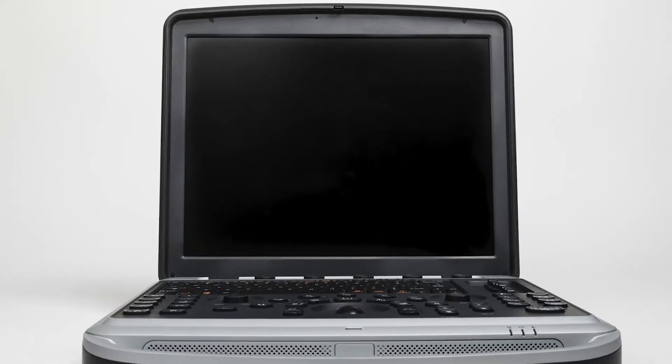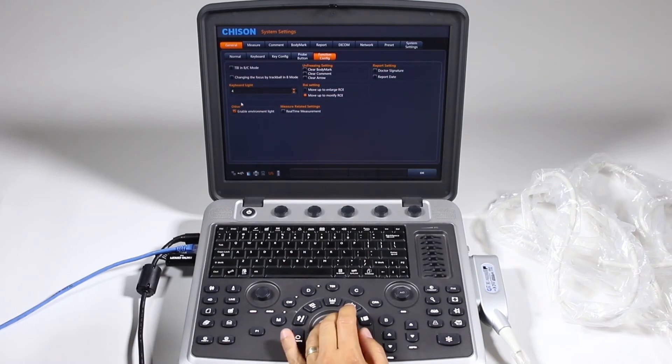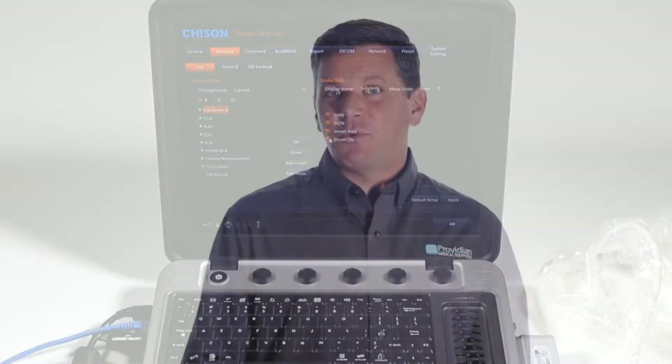Now let's look at the SonoBook 9's strengths over the SonoSite Edge. First, it has a 15-inch LED versus the 12.1-inch on the Edge. It has user-defined custom presets and extensive system customization. You get a trackball instead of a trackpad. It is more ergonomic for more intensive diagnostic situations. It also has a better keyboard for typing, stress echo, a 128-gigabyte hard drive instead of 8 gigabytes on the Edge, and 4D obstetrics.